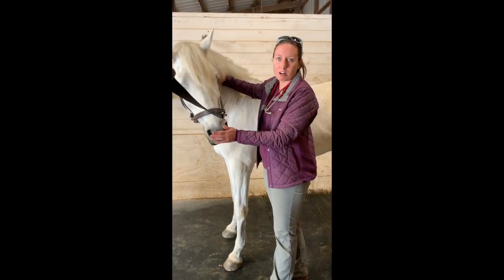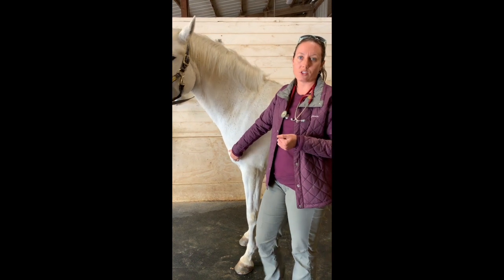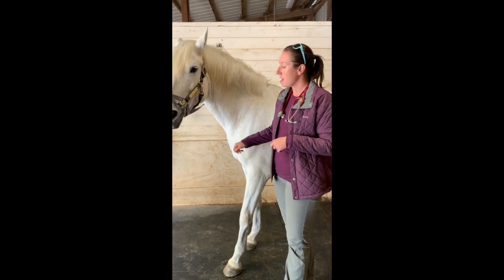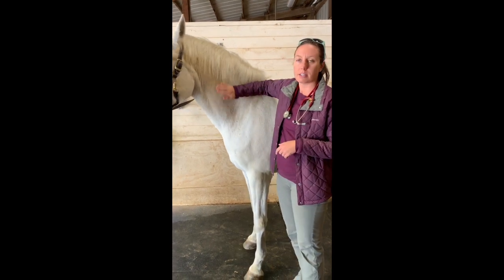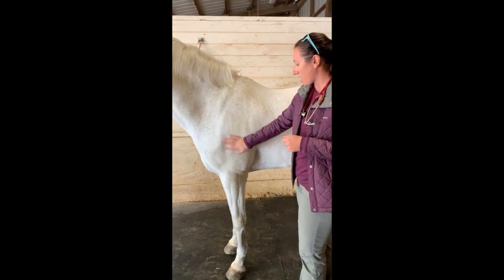Hi, my name is Dr. Cara Wright with Starwood Equine, and I am here today with Willow. We are going to show you how to do a general TPR — temperature, pulse, and respiration — on your horse. We're going to start with the heart rate.